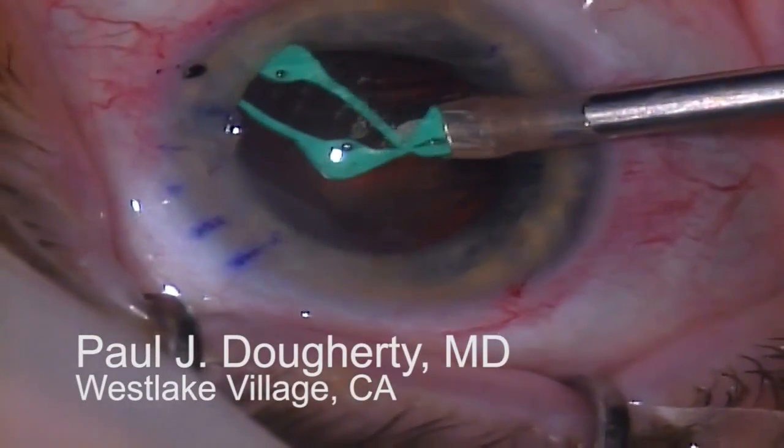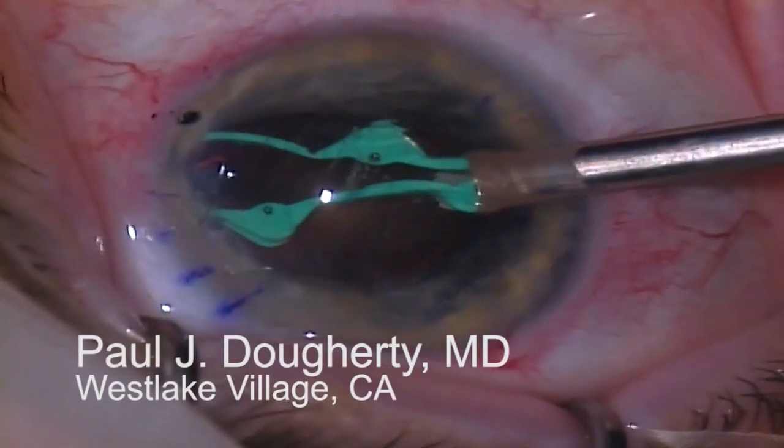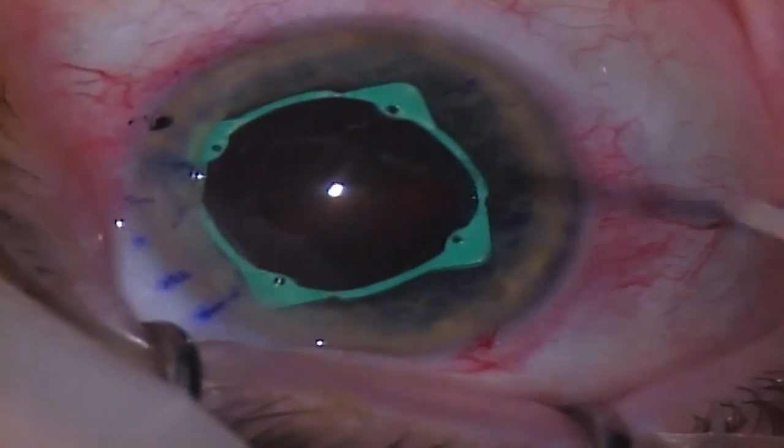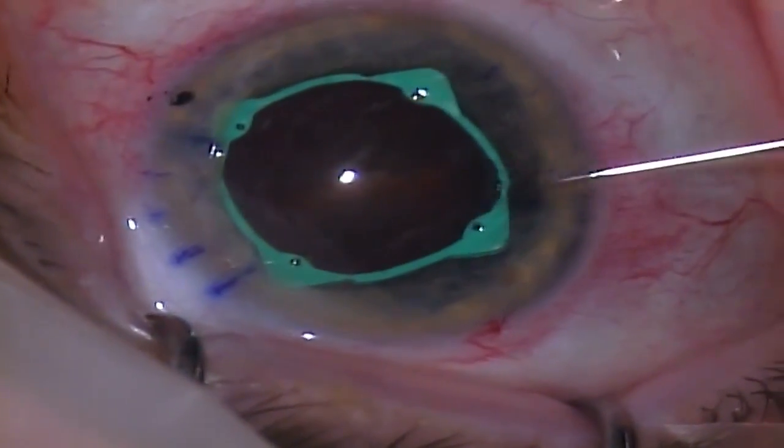As I inject the eye ring, I attempt to engage all the channels by pressing the leading edge of the ring against the iris. As the ring expands, I guide the horizontal channels into place. In this case, I get three engaged.